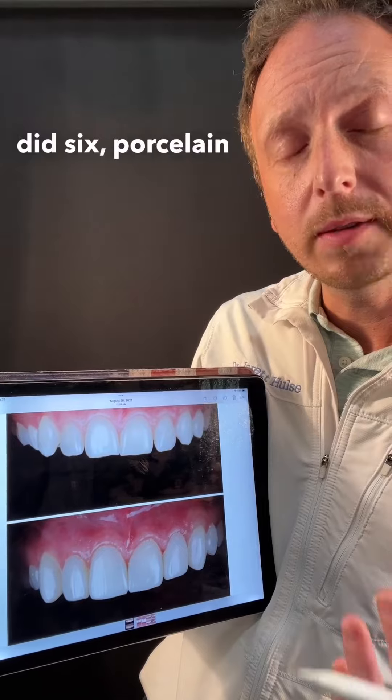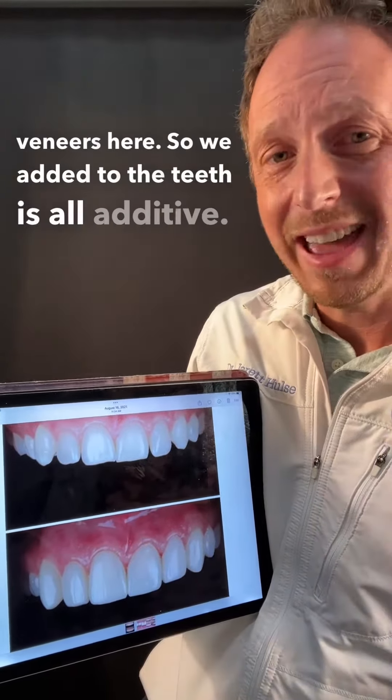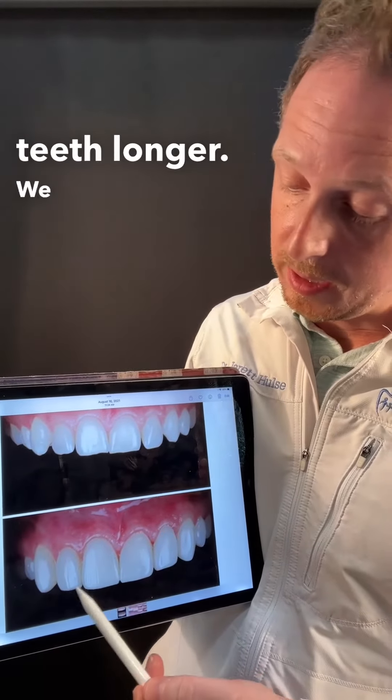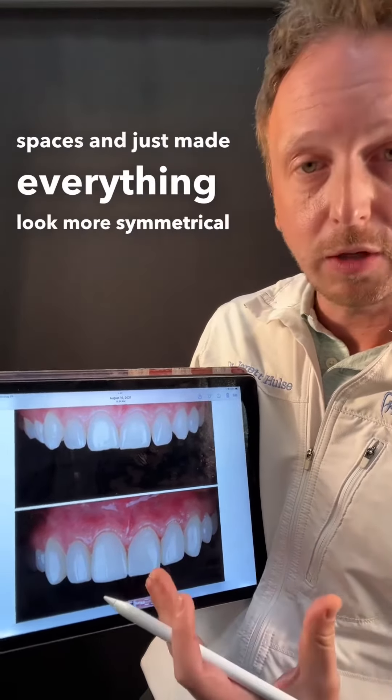Here's a close up of what we did. I did six Bioclear composite veneers. So we added to the teeth — it's all additive, nothing was removed from her tooth. We made the teeth longer and closed those little gaps and weird spaces, making everything look more symmetrical and uniform.